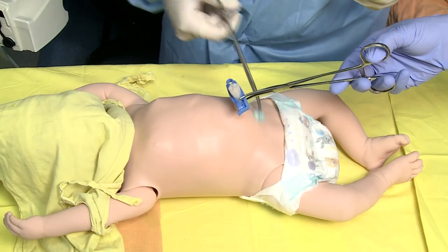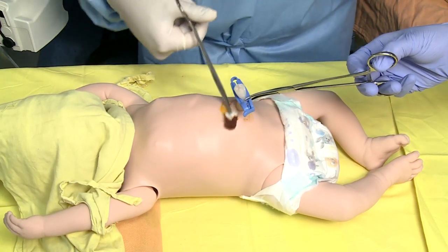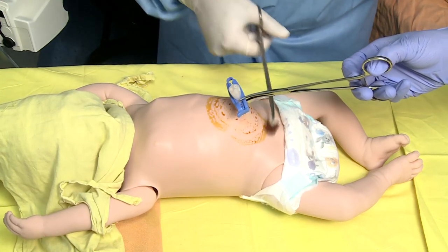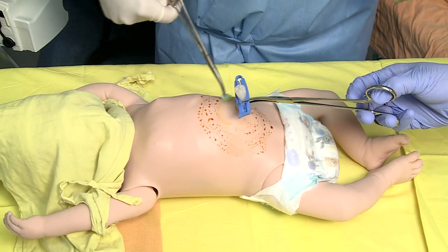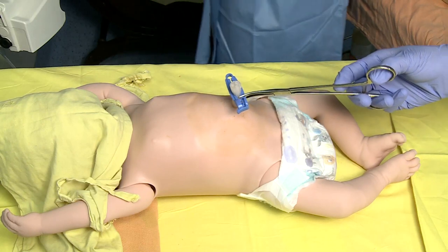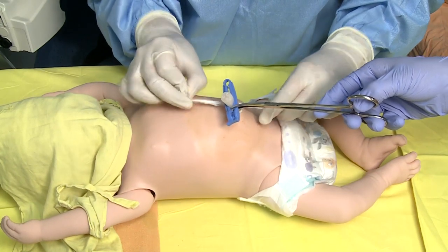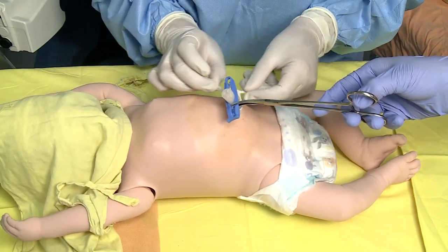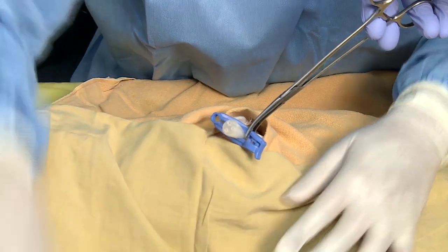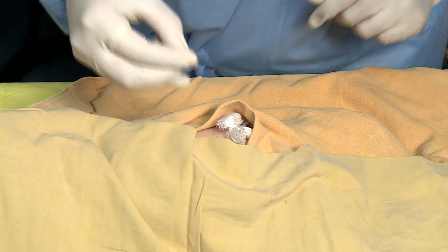Ask the circulatory nurse to hold the cord with sterile gauze or artery forceps. Clean the cord and the surrounding skin up to a radius of 5 cm with antiseptic solution using triple swab technique. Place the cord tie around the base of the cord and tighten to prevent bleeding.